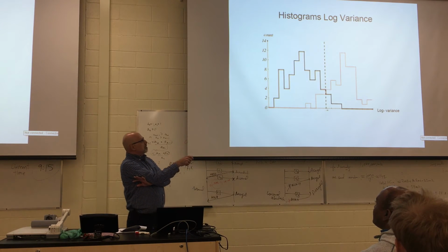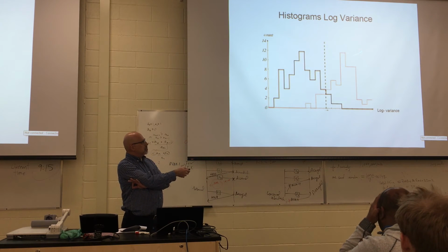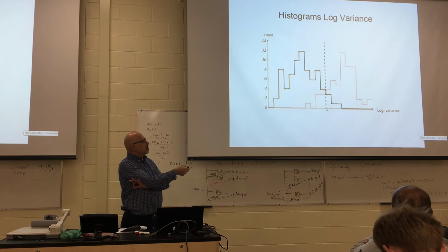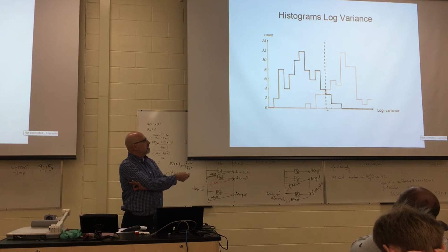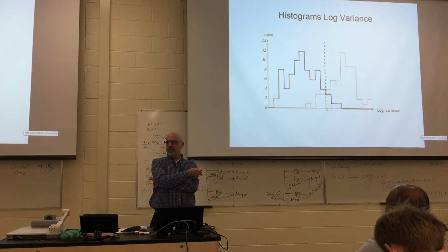So if we choose this threshold, you can choose the threshold by moving it around and optimizing it so you get the maximum accuracy, right? So you change the threshold, and there are other mathematical ways of doing it, like minimum Euclidean distance, which I'm not going to get into. But again, you can choose the threshold here and say everything to the right of that threshold that has log variance greater than this, we'll classify as bad signal. Everything to the left of that, we'll classify as clean signal. And then you can look at the tail here and the tail here, and see that this is not bad, right? The error rate here is pretty decent. But can we do better?